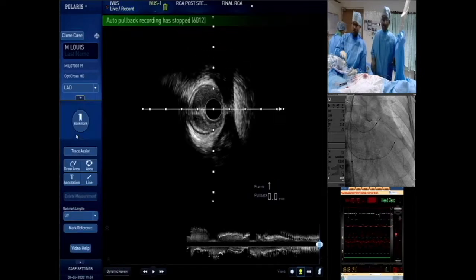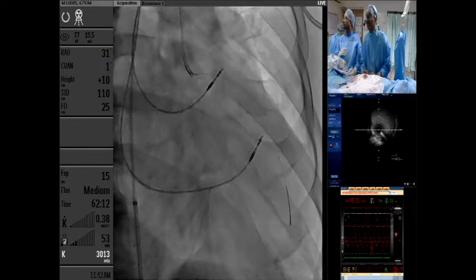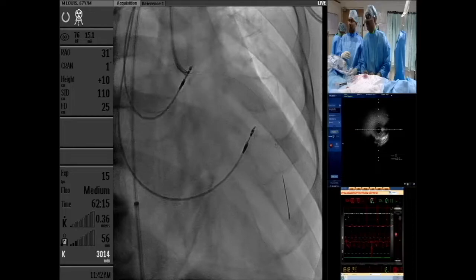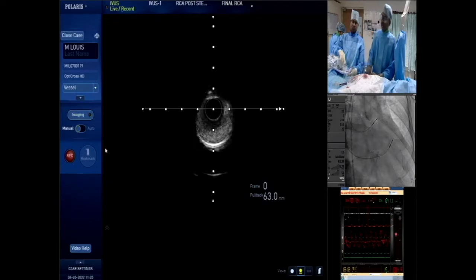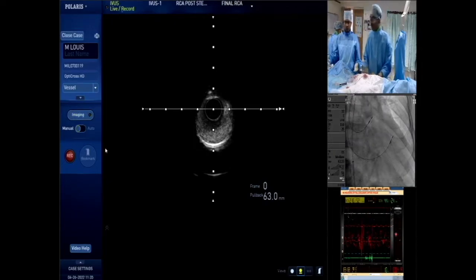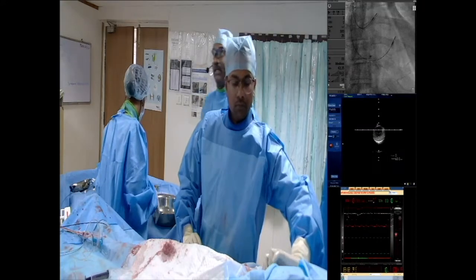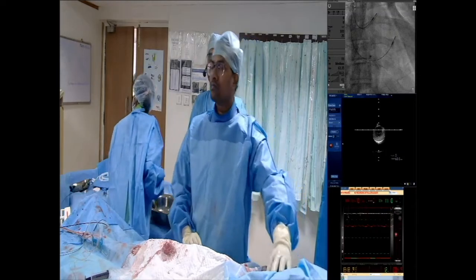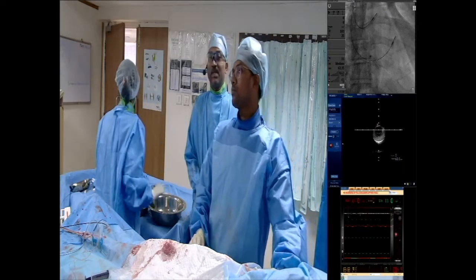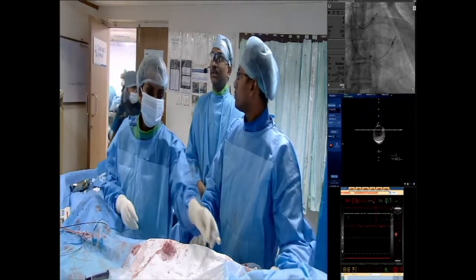So that's fine. Manual, please. I would always prefer to see up to the ostial LM. Because this is the ostial LM, we have not caused any damage. So I'm coming out. This is how we can make sure about your retrograde vessels, whether you did any damage or not. Yeah, this is a minimal contrast CTO. We have done an RCA CTO opening with 4 ml in a patient with renal failure and creatinine of 3.7. So fine. Yeah. So thank you.